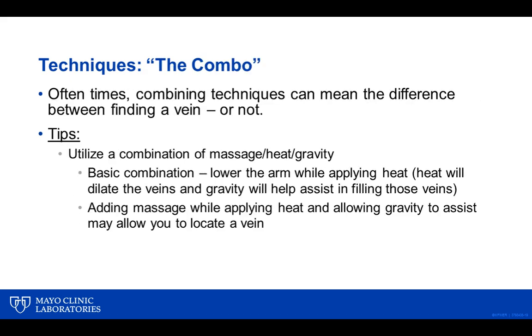Combos, put it all together. Use all of it together sometimes. If you have real difficulties, use heat, massage, lower the extremity or the arm. All those things working together, a lot of times a vein will pop up and you'll be able to use it.